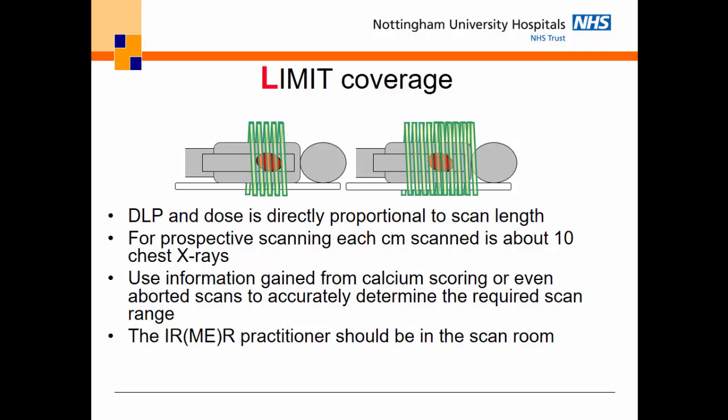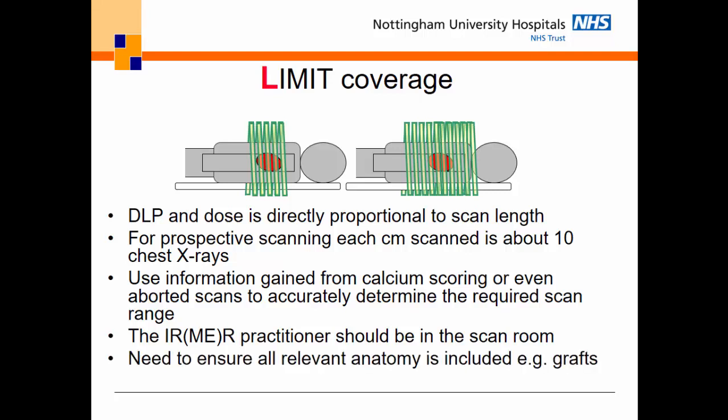And I would suggest the radiologist or the cardiologist, certainly when you're starting out, should be in the scan room during scanning. Okay, you need to be able to discuss the cases with the operators, work out what technique you're going to choose. You need to know how successful they are at scanning. You need to know what the image quality is like when they scan using the parameters that they do. Okay. After you've had a scanner for a long time and the operators are all familiar, you may not need to do that, but certainly in the early days, you need to be in there with them. And if you're new to this technique, you need to learn as well, okay? So I would suggest you're in the scan room for the cases.